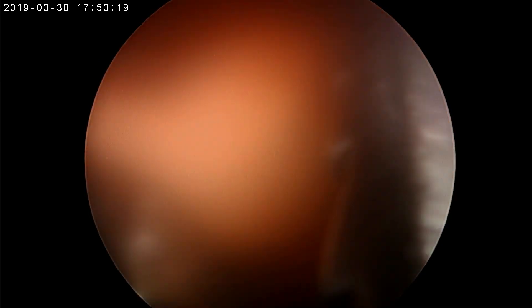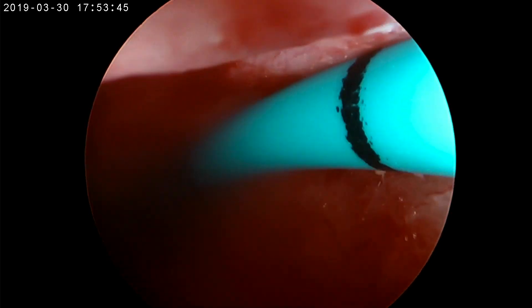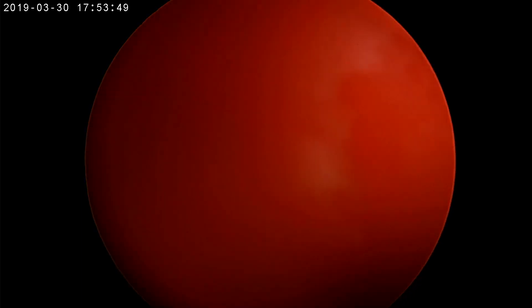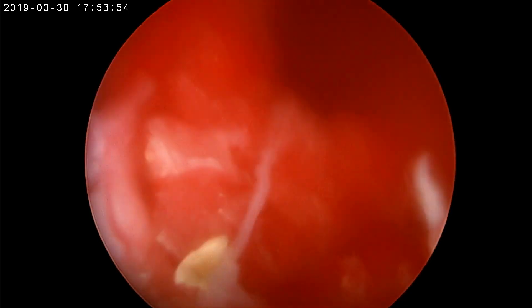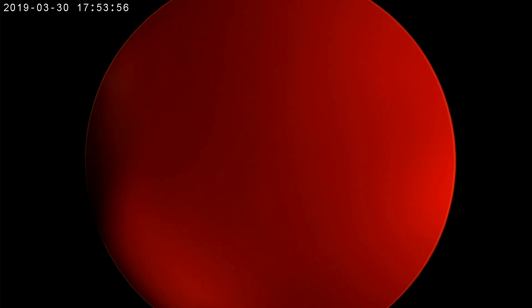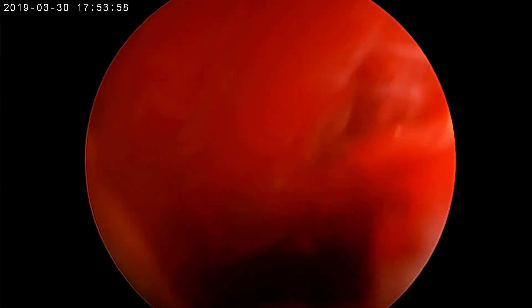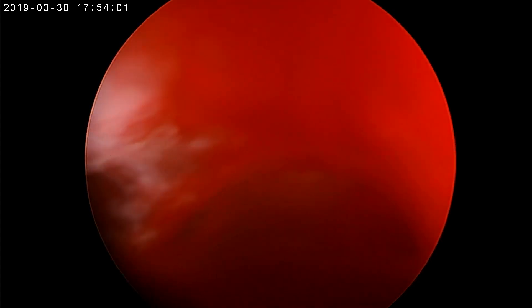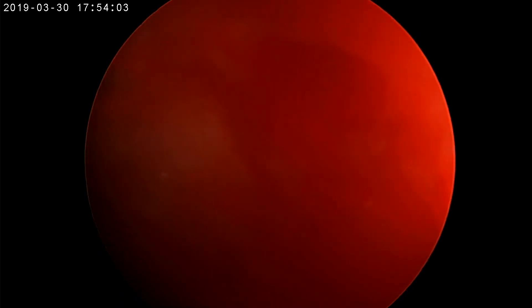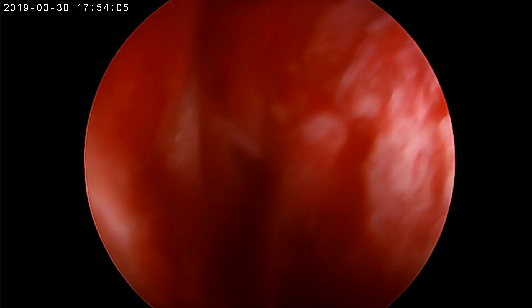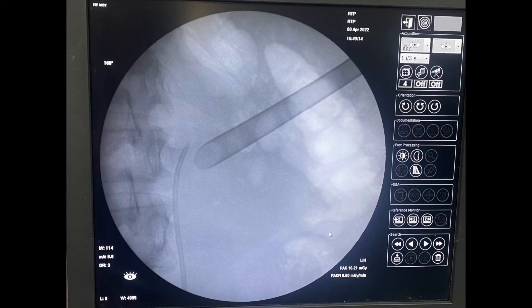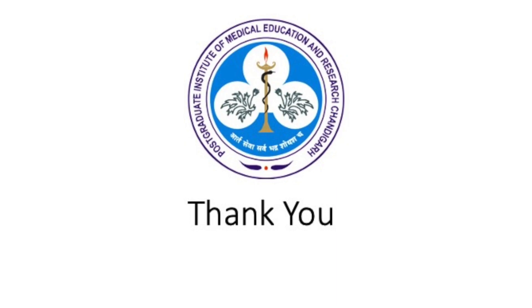This orientation — the calyx turning medially on rotating the C-arm from 0 to 30 degrees — helps you understand whether it is an anterior or a posterior calyx, and you use that as guidance to go inside and identify residual stones. This is how over a period of time you can master PCNL to achieve complete stone clearance. A final check fluoroscopy confirmed complete clearance of all stones from the inferior calyx and the residual calyx previously identified.